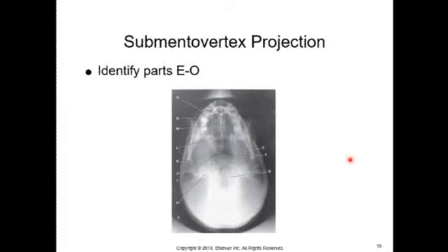SMV, you would most likely do for facial bones. If you were to get this image for cranium, you would not really be responsible for naming the facial bones portion of it, but the cranial portion of it I absolutely would want you to label for me. Particularly the foramen that you can see here, and that's why I'm using that in particular as an image. I know this is just as hard to see as the sutures, but right here and right here, E and F, those are pointing to 2 foramen that you need to know.